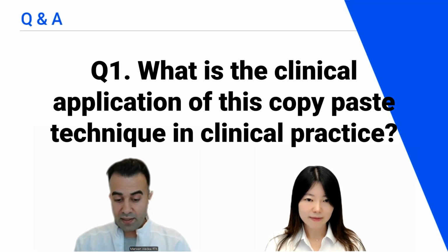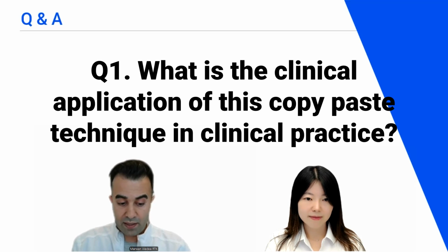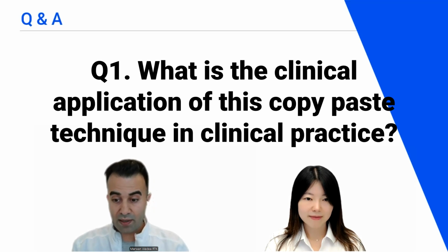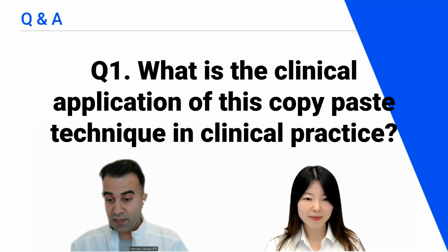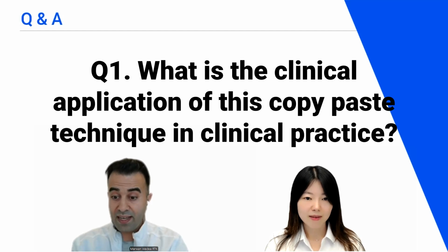And the next question would be, does any of her daughters, for example, have a similar smile, and you would see some patients would say, I would love to have a smile like my daughter's. And that usually would resemble their younger selves. In the past, in the analog workflow, these things were really impossible to replicate. And that's the technique that we can actually achieve.